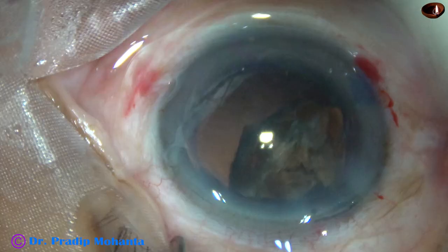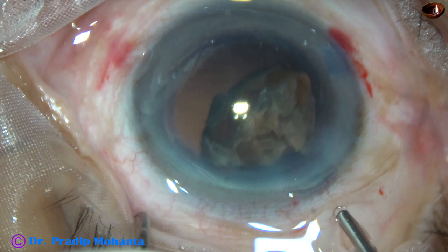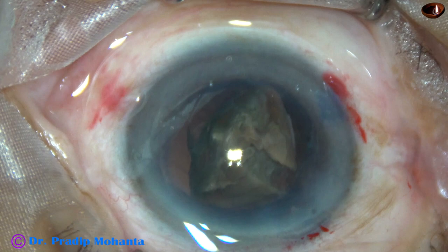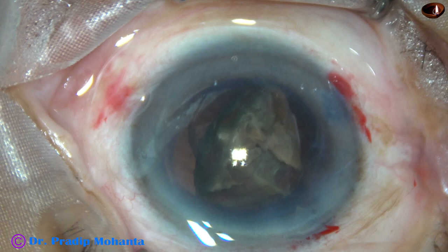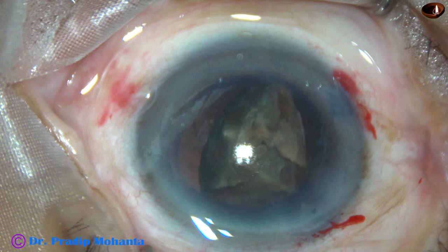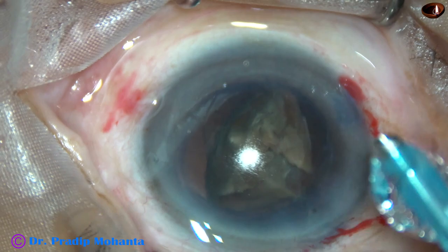At this point I have to come out because we have to change the BSS bottle. Before coming out, I asked my assistant to inject visco. The idea is, if we don't inject visco, this large piece will come anteriorly and hit the corneal endothelium. To prevent that, I asked my assistant to inject visco and then came out. Now the bottle has been changed — a fresh bottle of BSS — and here I go in again.